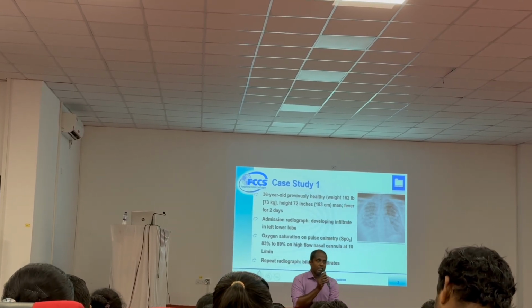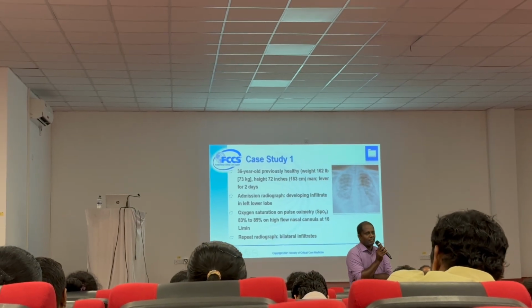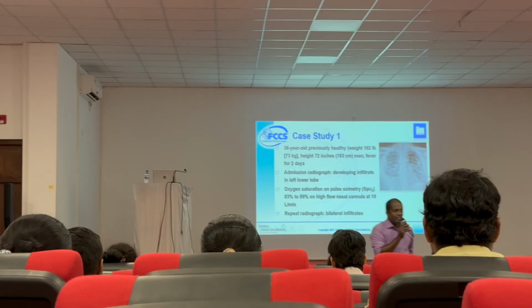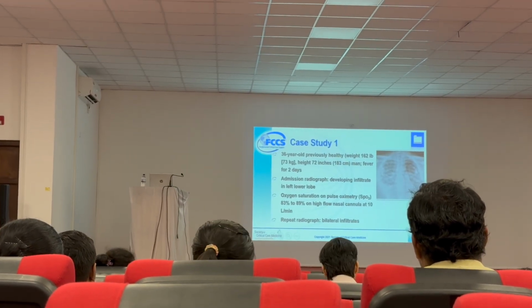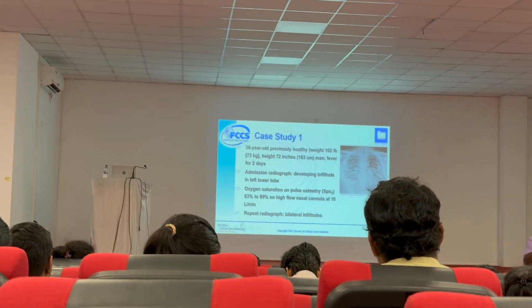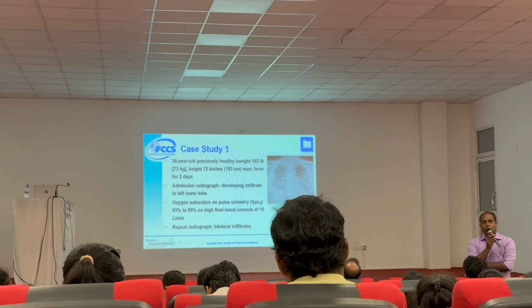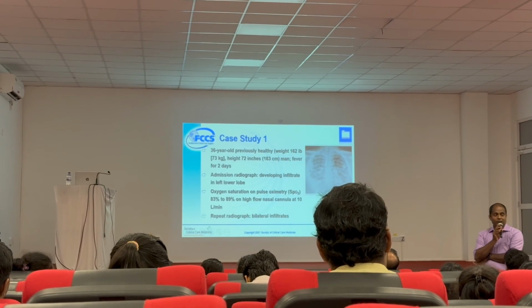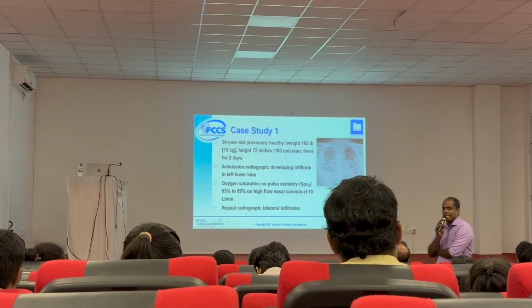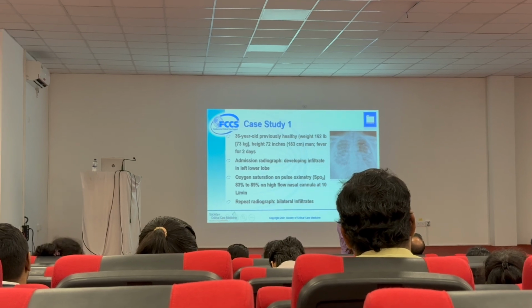So what are the parameters controlling the oxygenation? What are the parameters dealing with oxygenation in any patient, whether physiologically breathing or on a mechanical ventilator? The first one is how much oxygen he is taking. That's FiO2, the fraction of inspired oxygen.